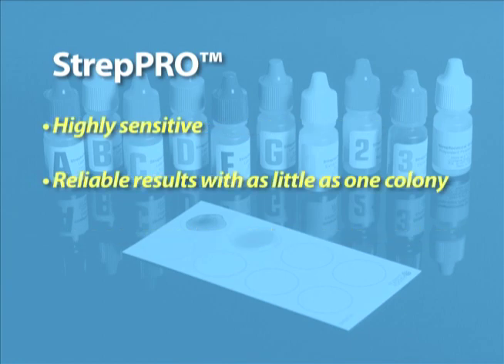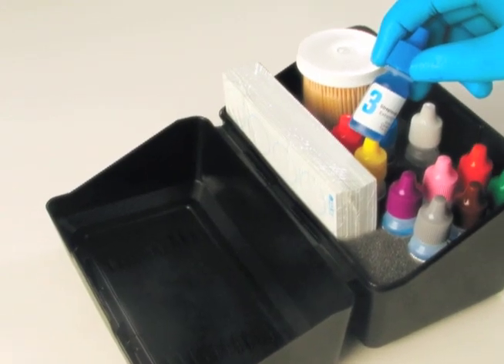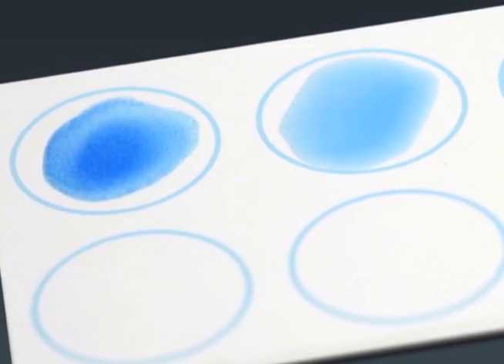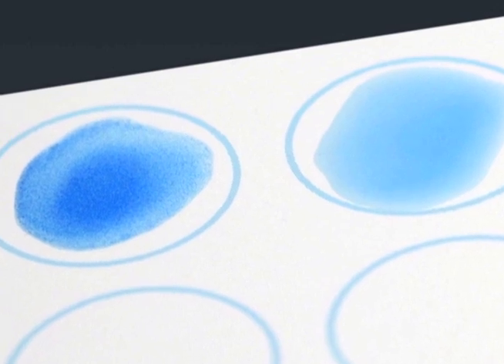Strep Pro is a highly sensitive method that requires as little as one colony to produce reliable results. Strep Pro gives you color-coded reagents that come in a convenient space-saving workstation. The large blue carboxylated latex beads produce a clear-cut readout and result in increased sensitivity and specificity without concern for cross-reactivity.